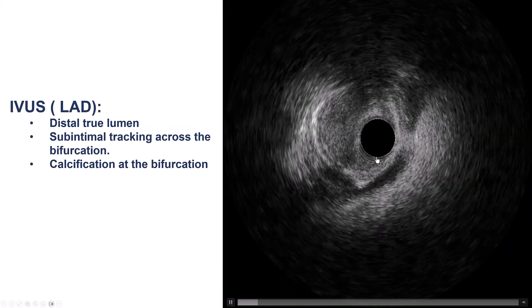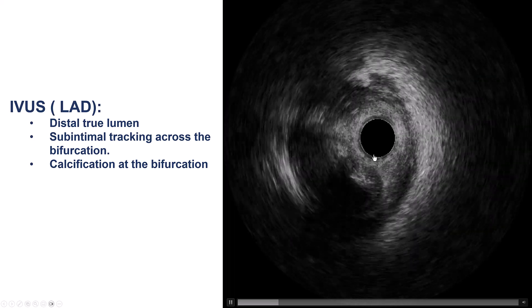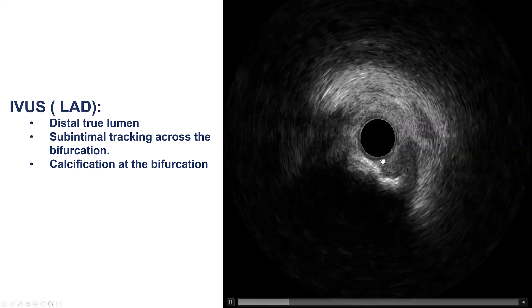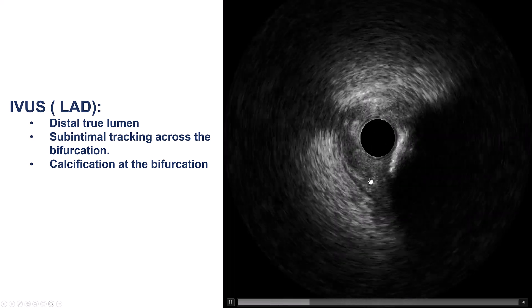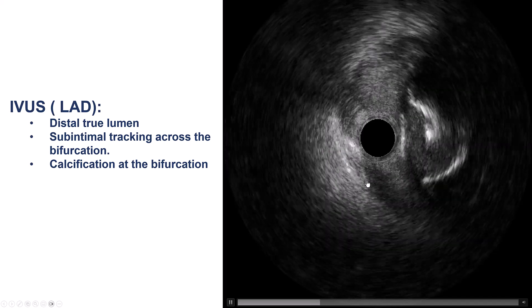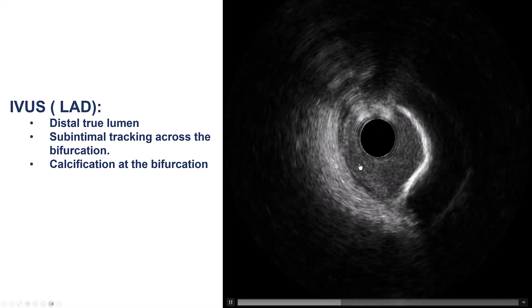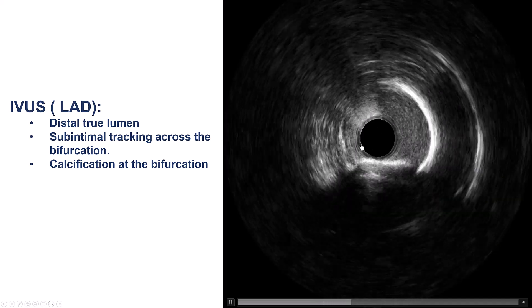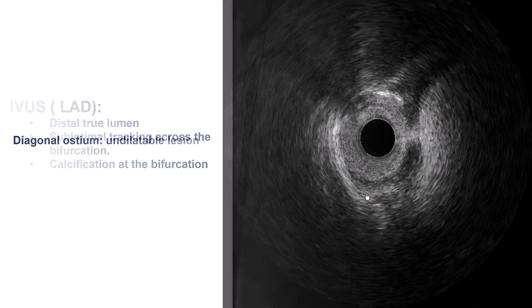The next step was to understand the anatomy better. We did intravascular ultrasound, which shows that distally we are in the true lumen. But as we come back, it looks like we are in the extra-plaque space, and more proximally things look okay.